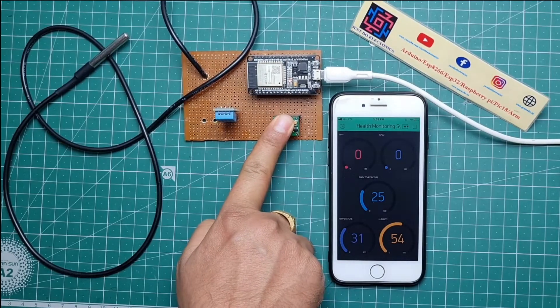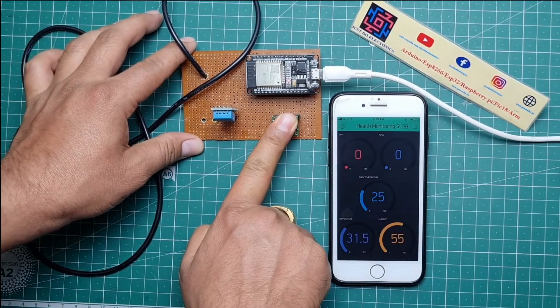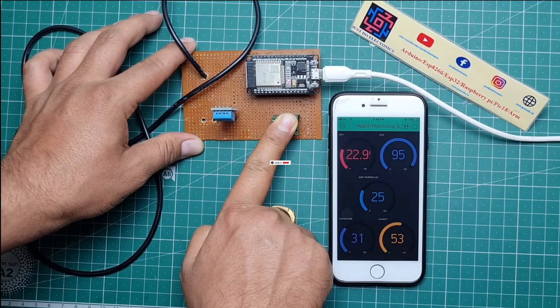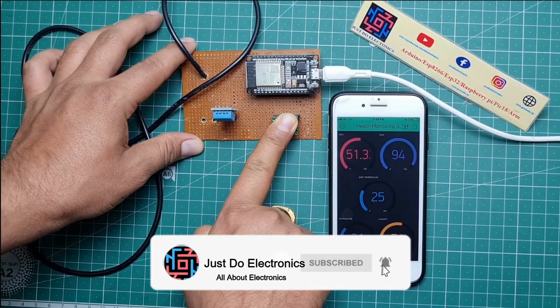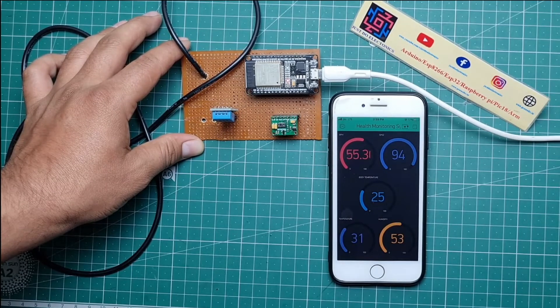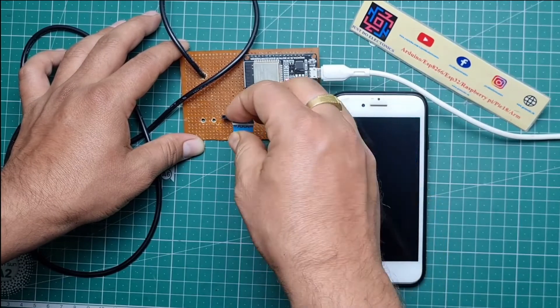Now you can see the BPM and SpO2 being measured by the MAX30100 sensor when I place my hand on it. In the Blynk app, the SpO2 level is showing 95 percent. It is also displaying humidity and temperature with the help of the DHT11 sensor, and measuring the correct SpO2 and BPM values.